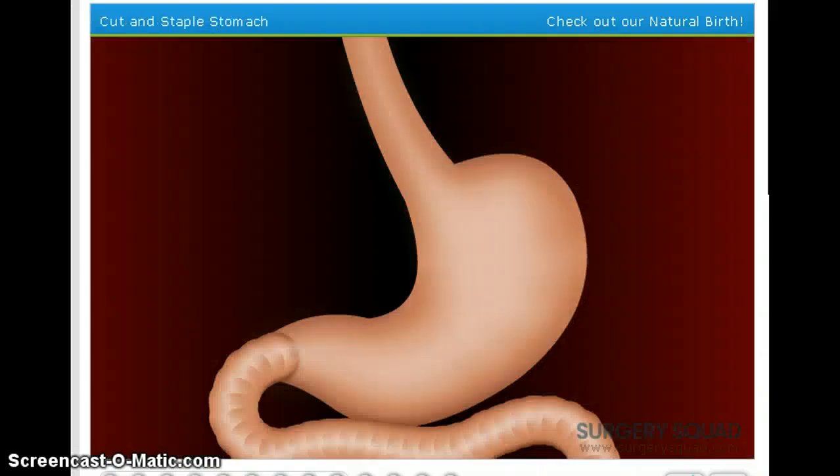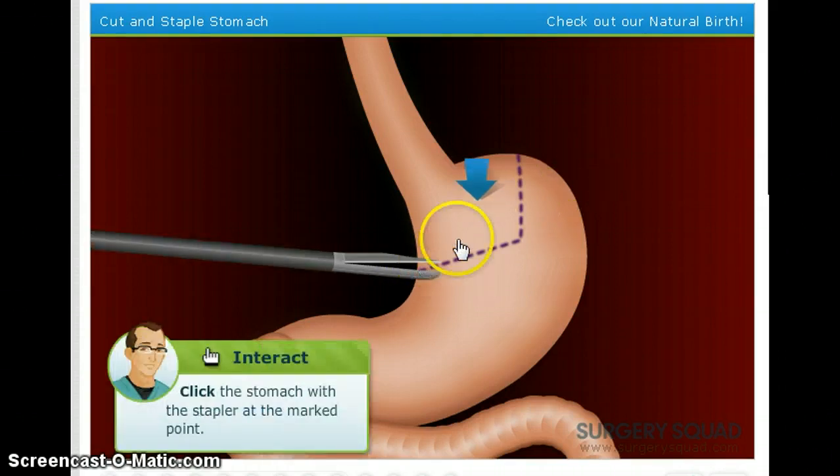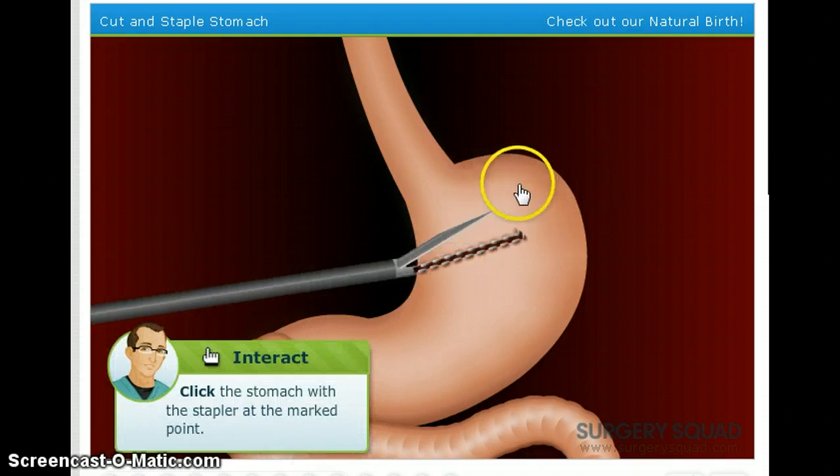Time to start the gastric bypass. We'll use this monitor here to see our work. In RNY gastric bypass, we eliminate up to 90% of the stomach by making the patient's stomach the size of an egg. We do this by first placing a line of staples that separate the smaller new stomach from the whole old one. Then we sew along the staple line to make sure there are no leaks. As the patient heals, scar tissue will form to create a permanent separation. Click the stapler where indicated to create the new stomach pouch.